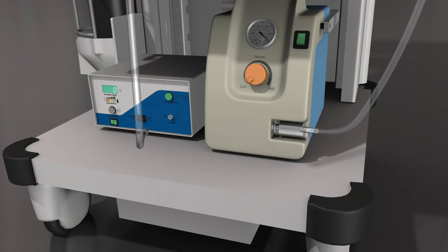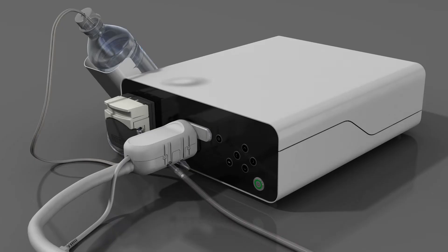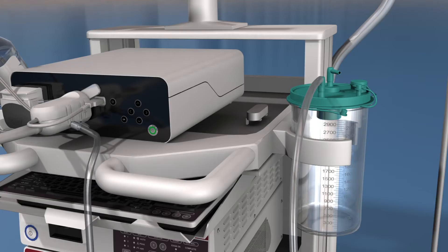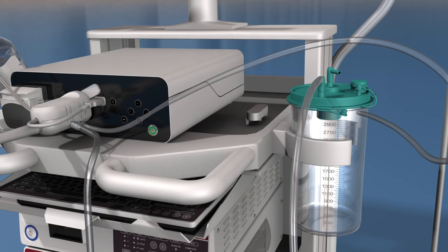Run tubing from the endoscopic insufflator and connect to the A-Scope Duodino via the Luer-lock connection provided. Use your existing suction system and tubing to connect suction to the endoscope by inserting the tube over the suction barb just behind the insufflator connection. This completes all mechanical connections.